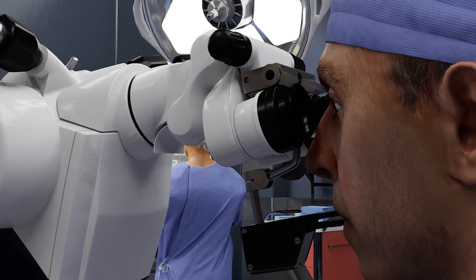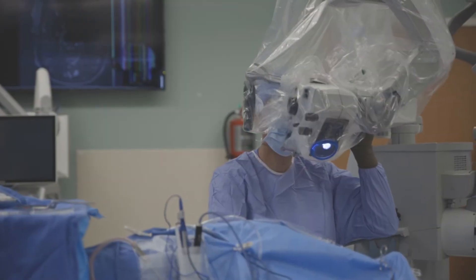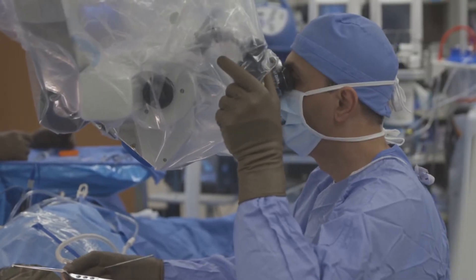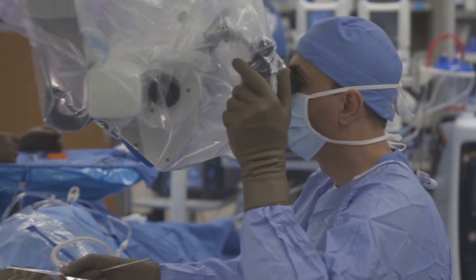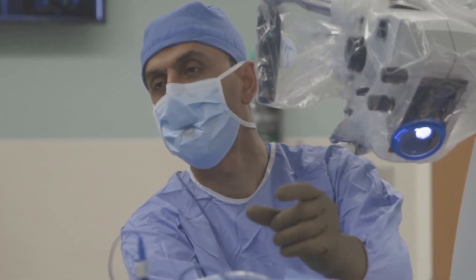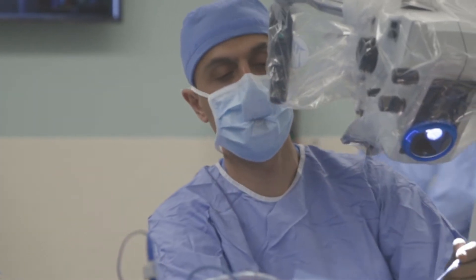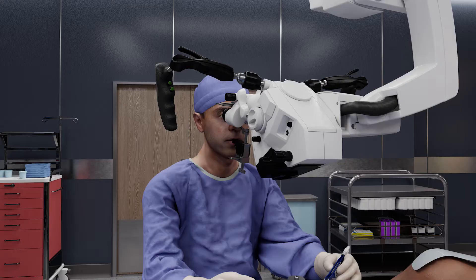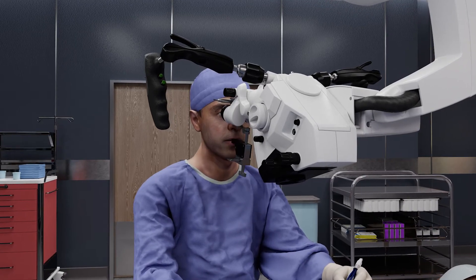One use case is neurosurgery. During a procedure, a surgeon needs to manually reposition a robotic microscope to maintain focus on the region of interest and align it with their instruments. This prolongs the surgery and increases a patient's time under anesthesia. Let's see how this can be improved with an AI-based solution using a digital twin.